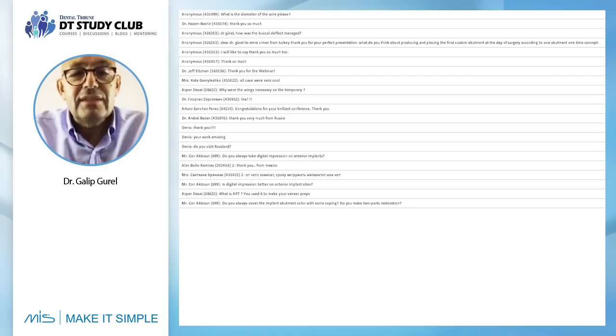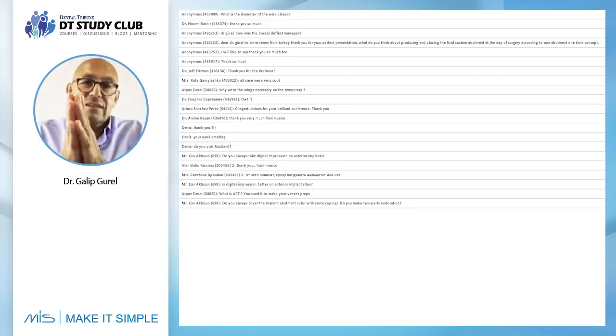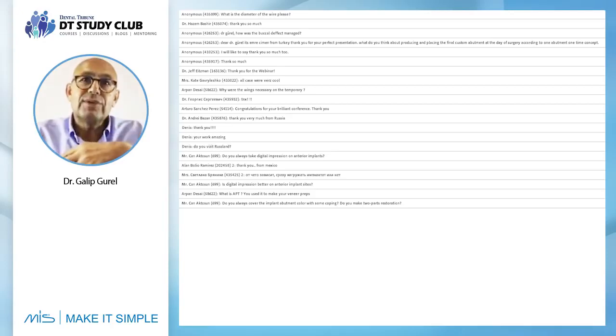Okay, what is APT? This is what I came out with years ago on Prospart. This is the transfer of the wax up over the patient's existing teeth, which gives you the exact final shape of your veneers in the beginning. So this is the best way. It's referred to as aesthetic pre-evaluative temporaries. You transfer the wax up into the patient's mouth before you even prep the teeth.